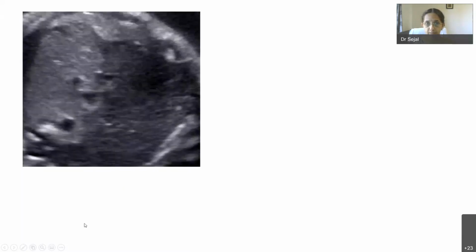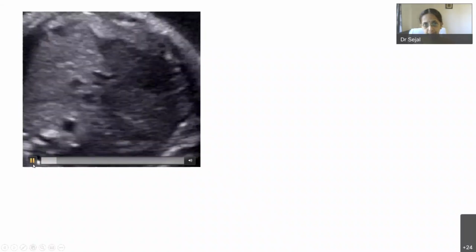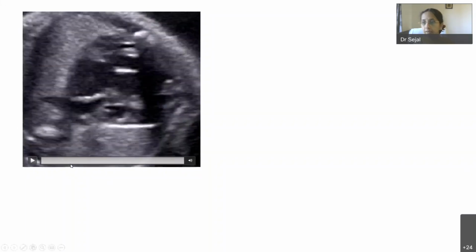Okay, now let's see this. What is this? All of you can answer in the chat box. Okay, any thoughts?